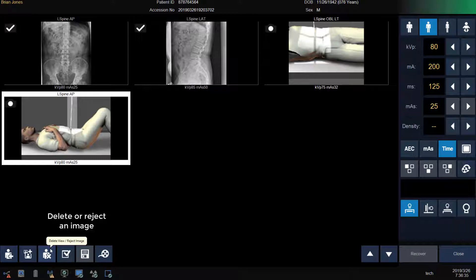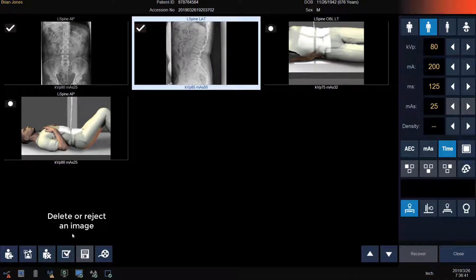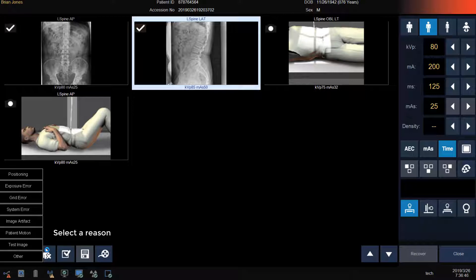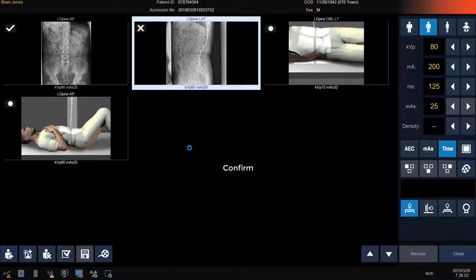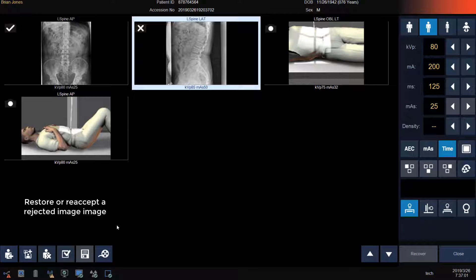If I want to delete a view that has not been used or reject an image that I don't want to send to PACS, click on the image and then click on the man with the X icon. Now I can enter a reject reason and confirm. If I decide that I want that image later, I can re-accept it by clicking on the image and then clicking on the icon with the check mark to restore or re-accept the rejected image and send it to PACS.